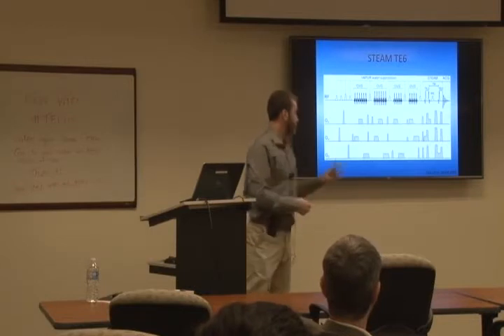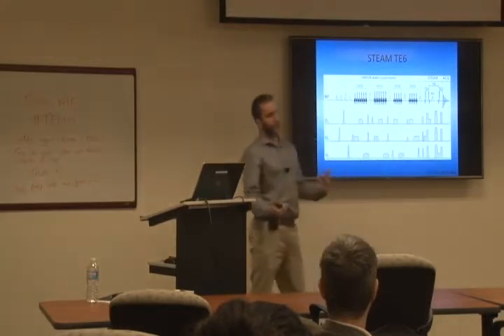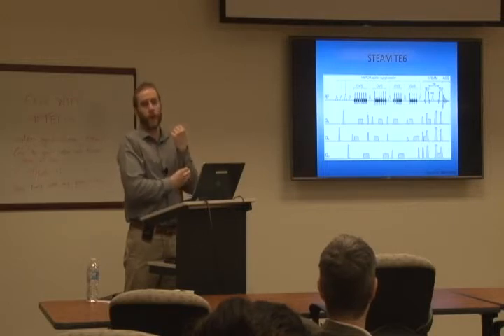The other 2 that I did was the 90 degree that was here, and then the 180 is there. Ideally, you would do both, but because there were two 180s and 180s are a little bit more sensitive, we decided to go with the 180s. That was what we optimized that time.